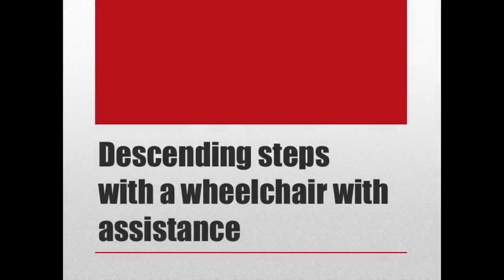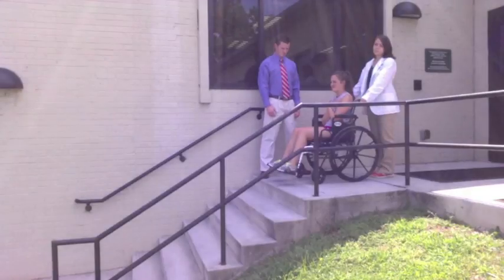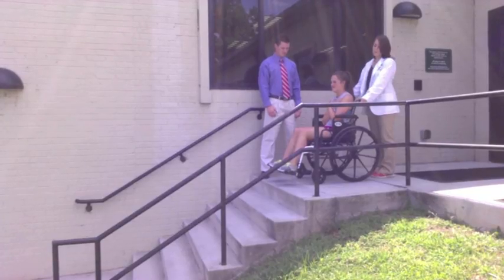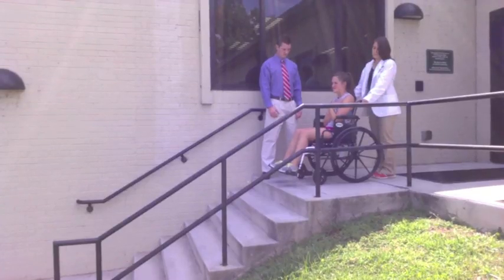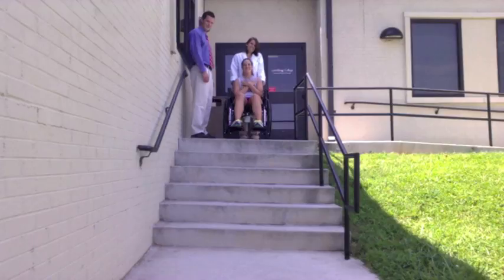Descending steps with the wheelchair with assistance. The clinician stands behind the wheelchair holding the push handles and positions the chair facing forward near the edge of the top step. Additional people assisting with the transfer stand at the sides of the wheelchair and grasp the frame of the chair.